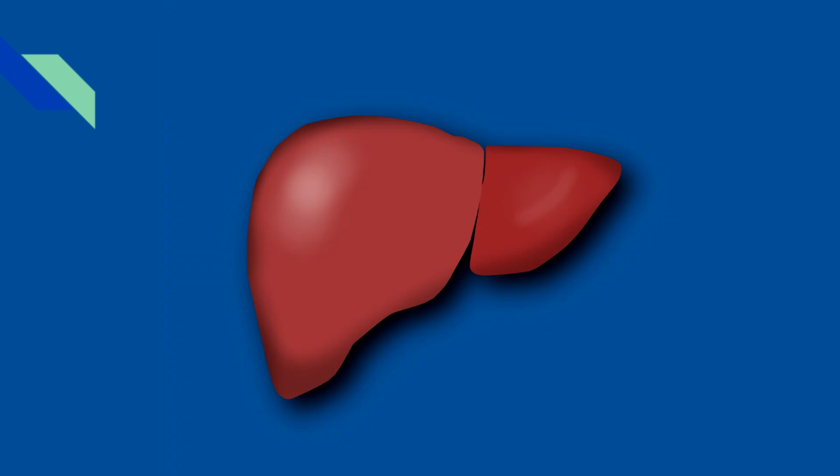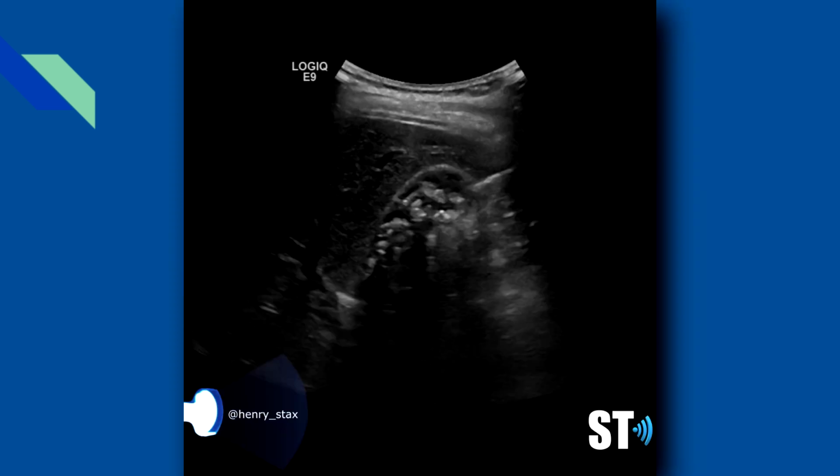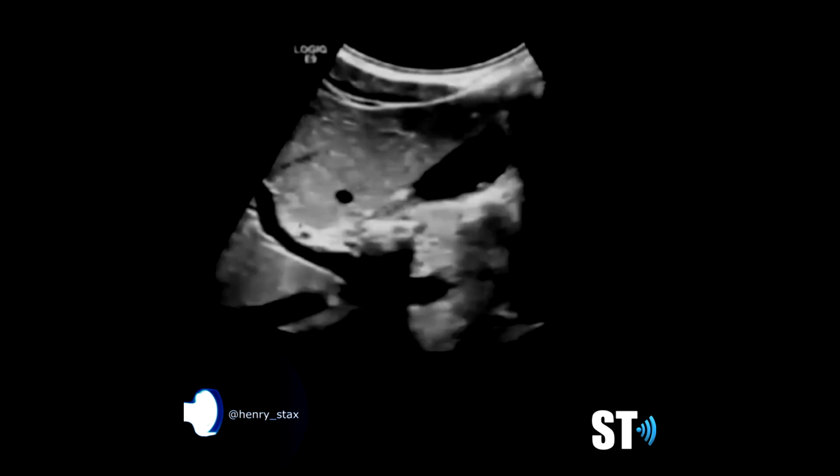The gallbladder can be completely filled with stones, obscuring the lumen, leading to the wall echo shadow sign, or WES sign. Mobility of the stone can be observed by scanning the patient in the left lateral decubitus position as well as supine. Scan the intra and extrahepatic biliary tree to look for dilatation, stones, or both.